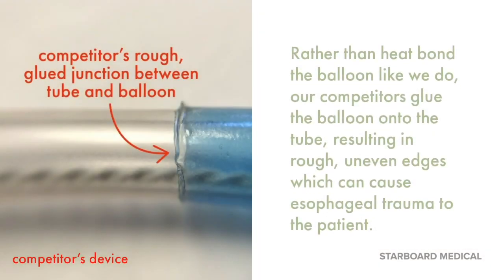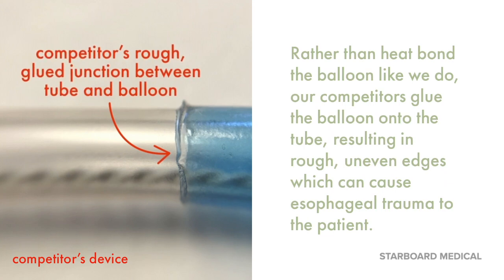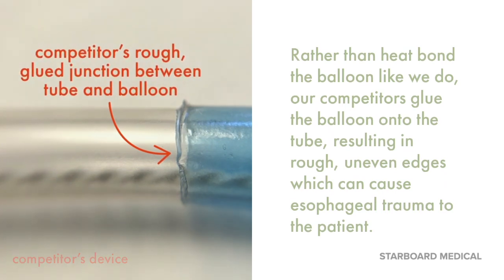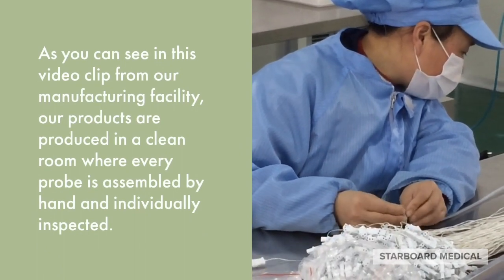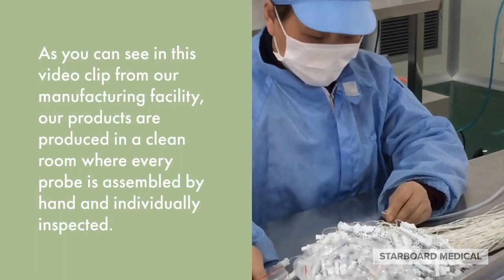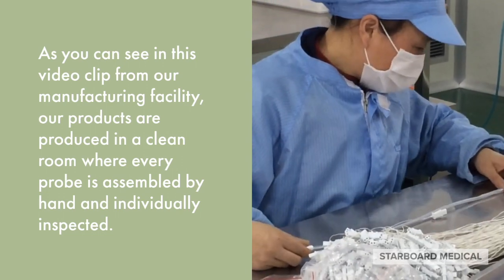Rather than heat-bond the balloon like we do, our competitors glue the balloon to the tube, resulting in rough, uneven edges which can cause esophageal trauma to the patient. As you can see in this video clip from our manufacturing facility, our products are produced in a clean room where every probe is assembled by hand and individually inspected.